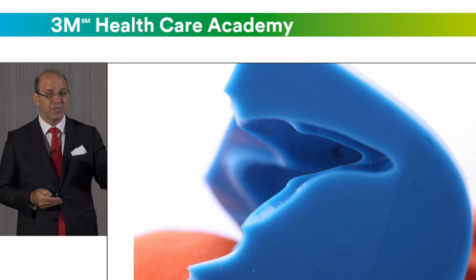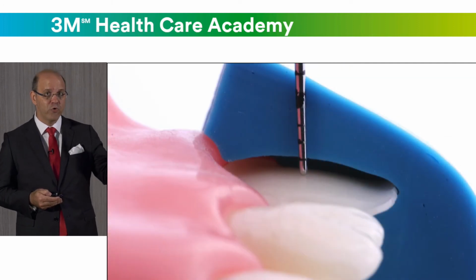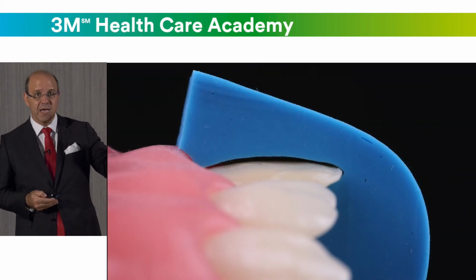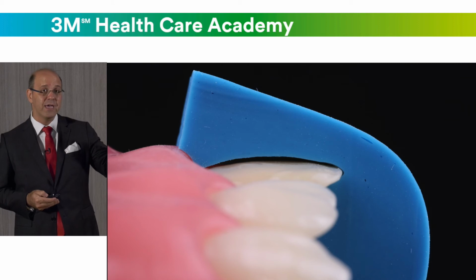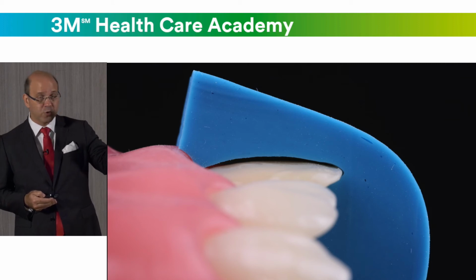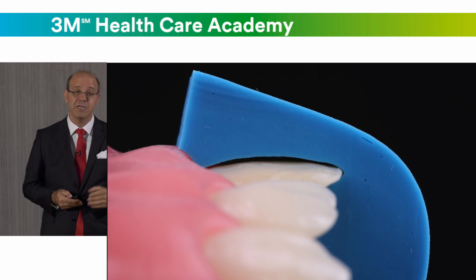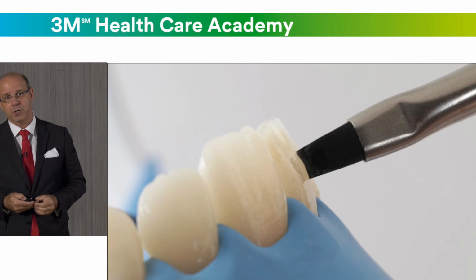If we put this silicone on the tooth, with a perio probe you can check, after you put your dentin, how much space you have for your buccal enamel. So in this way, you can calibrate from cervical to incisal the space for your composite resin restoration, even in some situations where the Misura doesn't work.